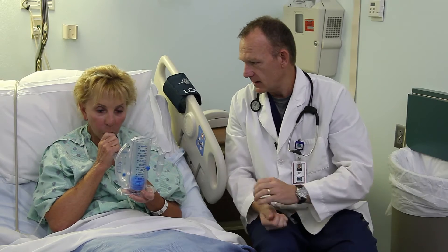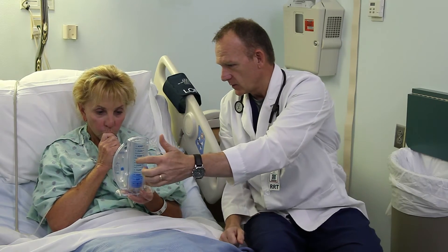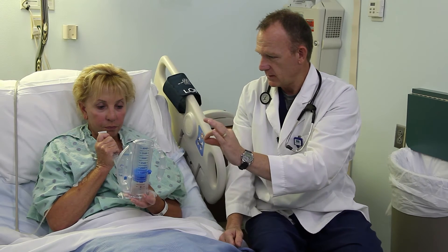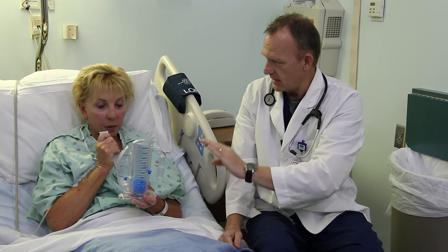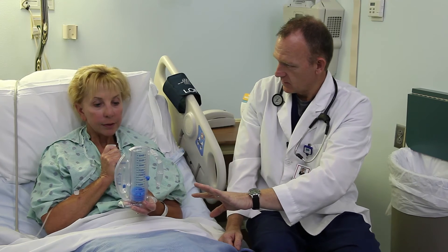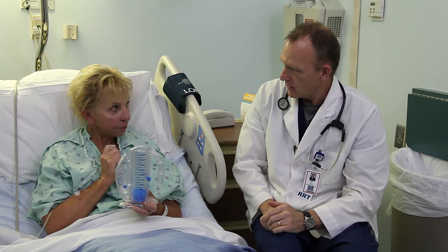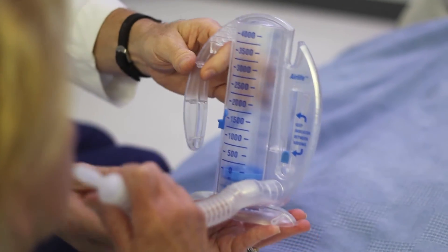Take a deep breath in — keep on going, keep on going — now hold your breath: one, two, three. Let it out. Usually you do that about every one to two hours, and about ten times every time you pick it up.